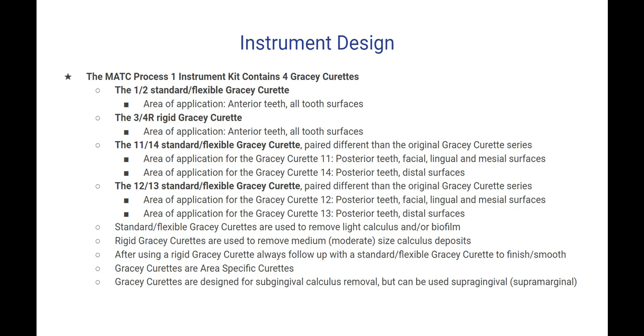After using a rigid Gracey curette, the clinician will always follow up with a standard flexible Gracey curette to finish or smooth the area. Gracey curettes are area-specific curettes. They are designed for subgingival calculus removal, but can be used supragingival or supramarginal.